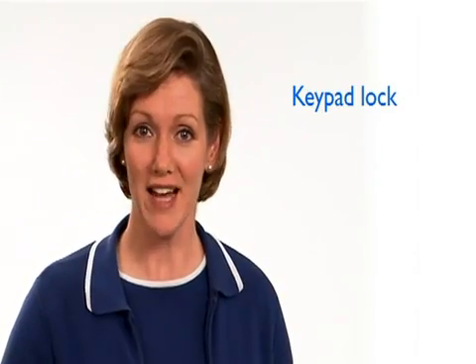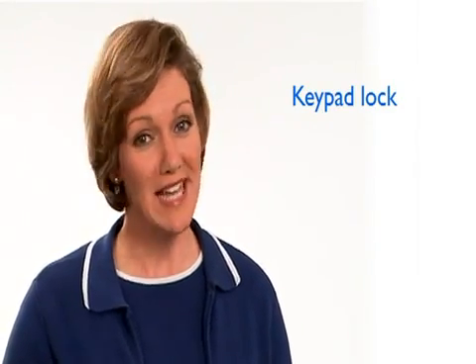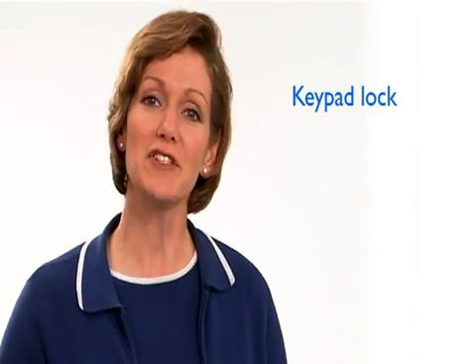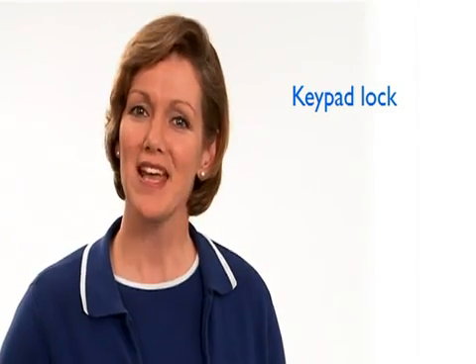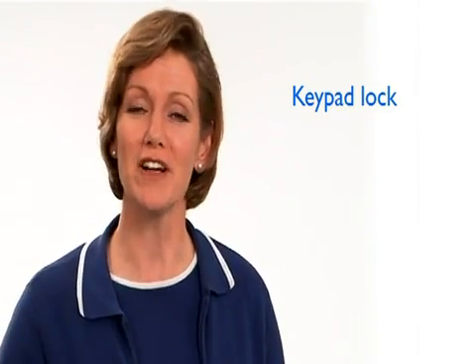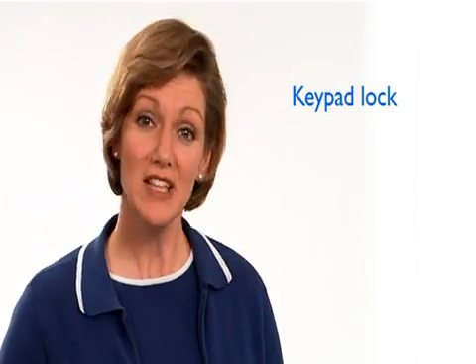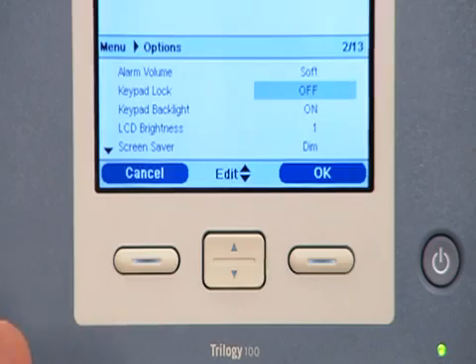The keypad lock option can be helpful to families with young children. When it is turned on, the left, right, and up-down buttons are locked. The audio pause and start-stop buttons continue to function normally. To lock out the keyboard, select Keypad Lock from the Options list.